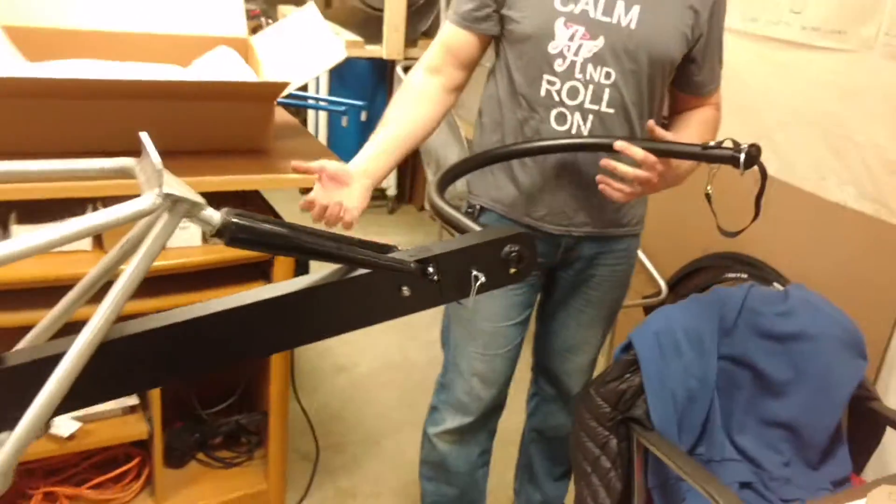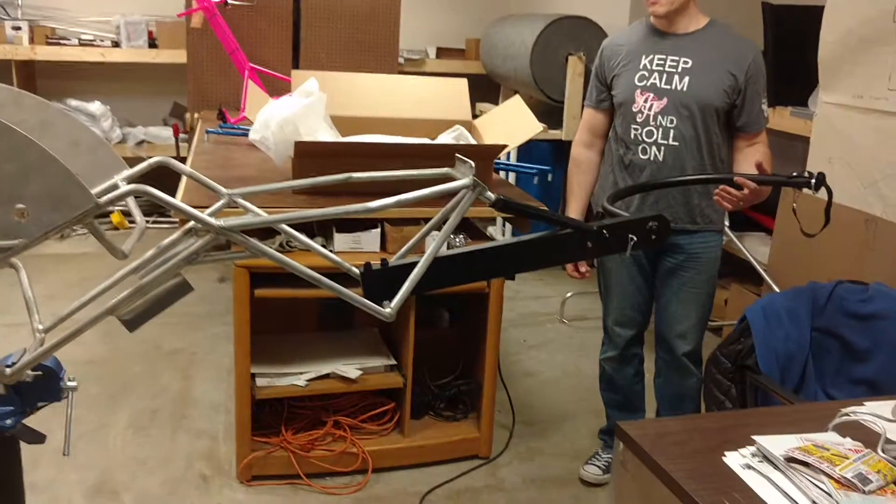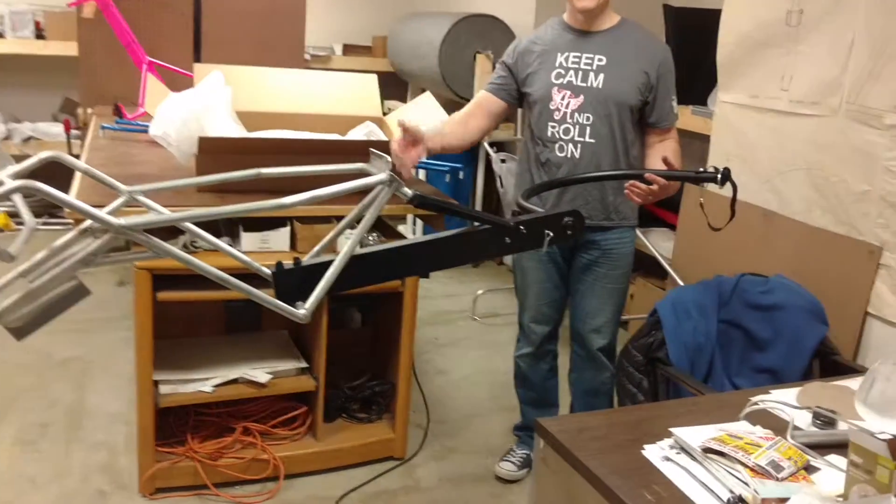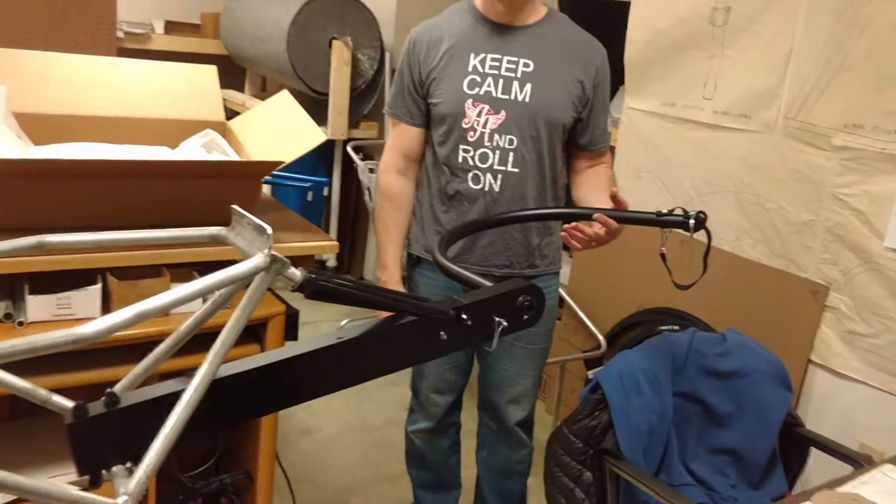This is what it looks like on the chair. It takes a little time the first time, but you get used to it. Great.